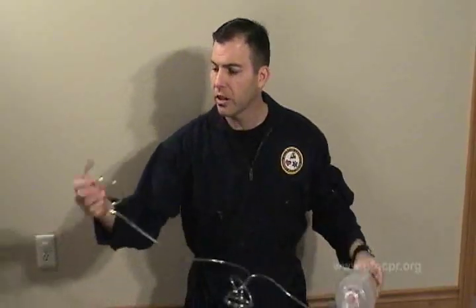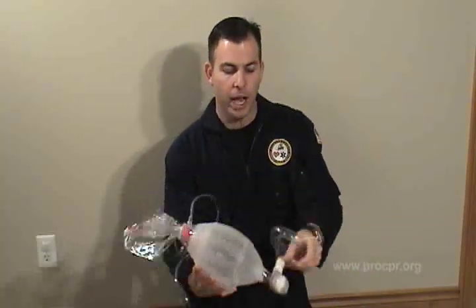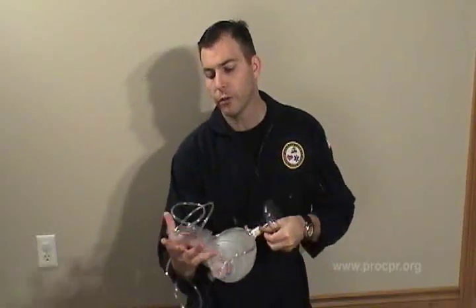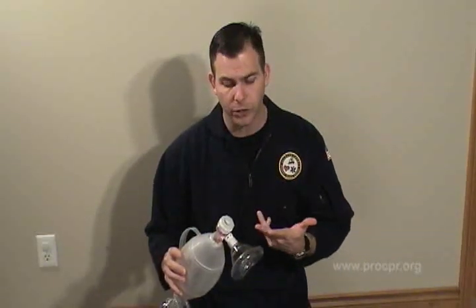We're going to connect this end to an oxygen nipple. We're going to plug the outlet to the bag valve mask and allow this reservoir to fill, and at that time it's now ready to deliver close to 100% oxygenation to the patient as long as we have a good seal around the mouth of the patient.